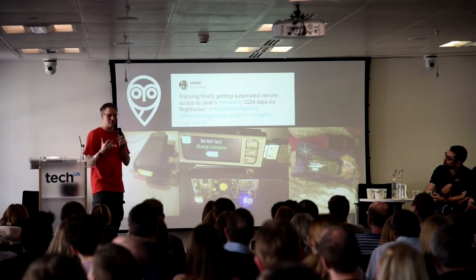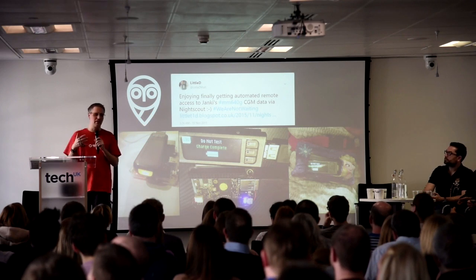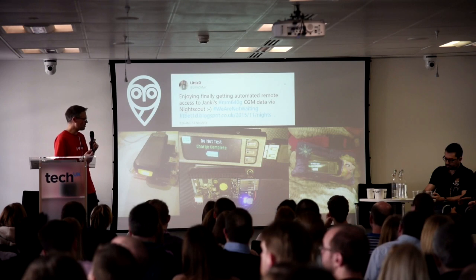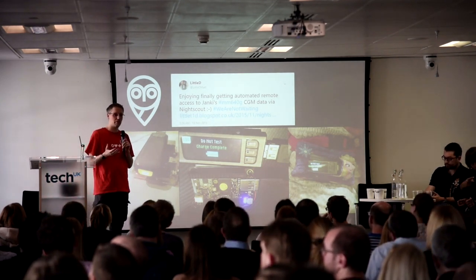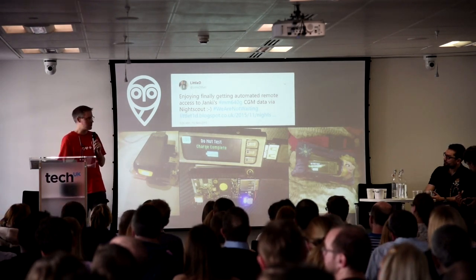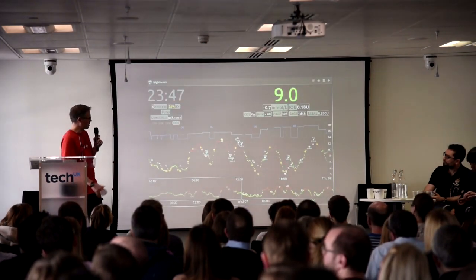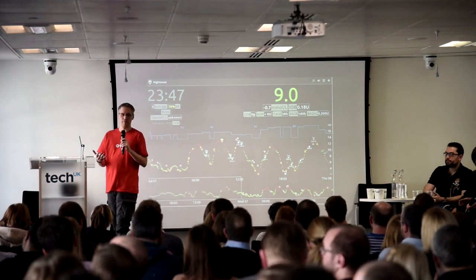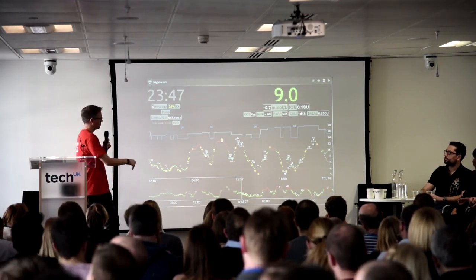I really wanted those numbers, not just because I'm a stubborn so-and-so, but because getting early track of things moving up or down would hopefully give us some better control. And using some code that Ben West had put together for the previous generation of Medtronic pump, I managed to cobble together something that did actually work on the 600 series. It wasn't pretty, but it worked. It proved that we could do it. And what we were able to get, this is all real-time data, so this was everything from the pump, not just the CGM data: insulin, carbs, everything coming over in real time, SmartGuard triggering on and off.